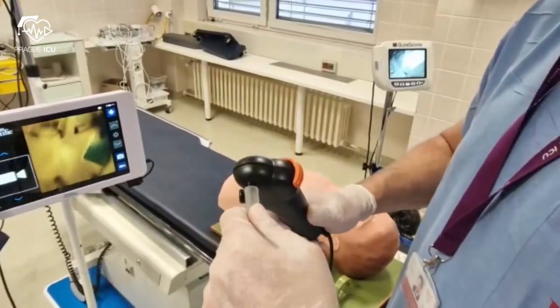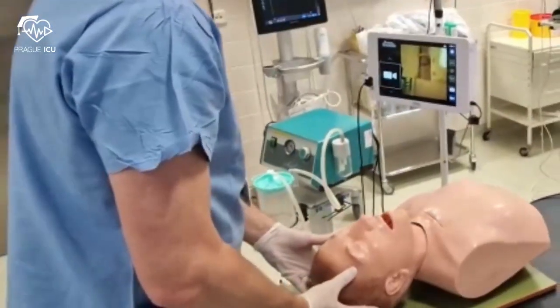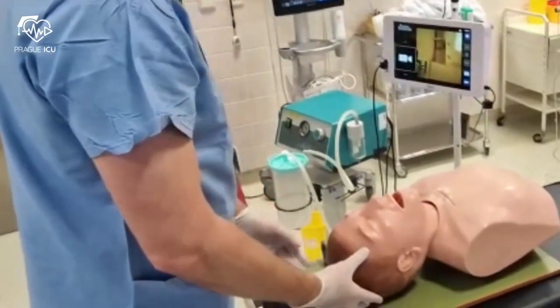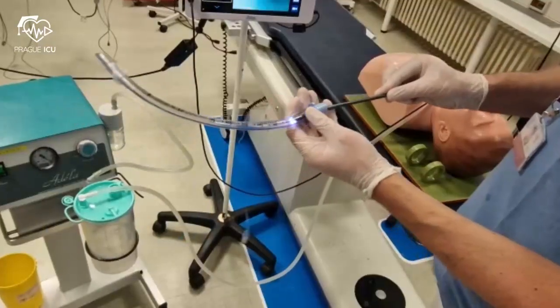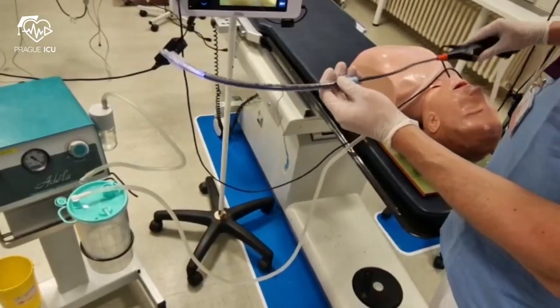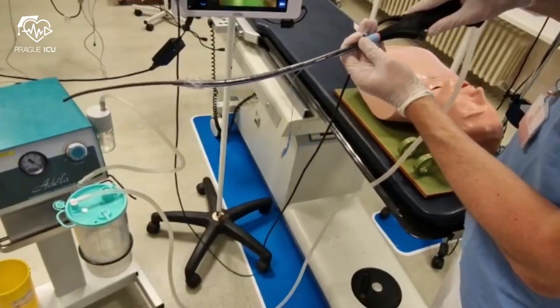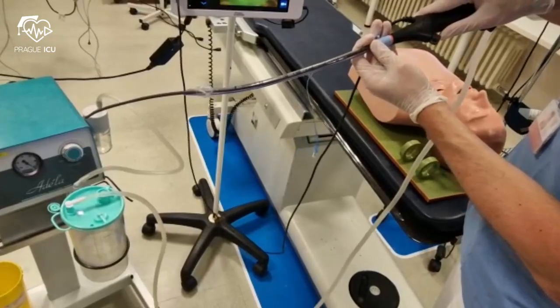After connecting suction to the bronchoscope, you are ready to go. Before the fiber optic intubation, hyperextend the head of the patient. Preload the lubricated ET tube on the very end of the fiber optic. Be aware that your ET tube needs to be at least 0.5 mm larger than the size of the bronchoscope.